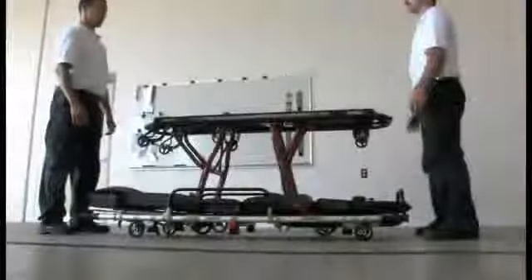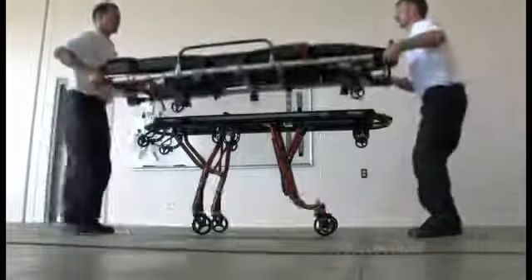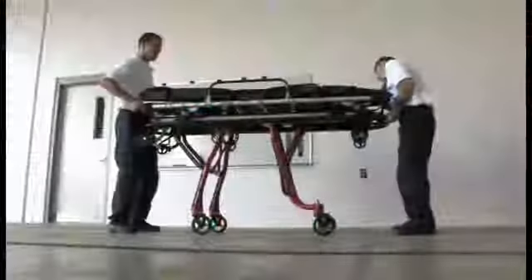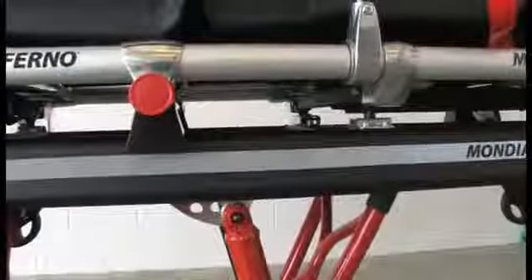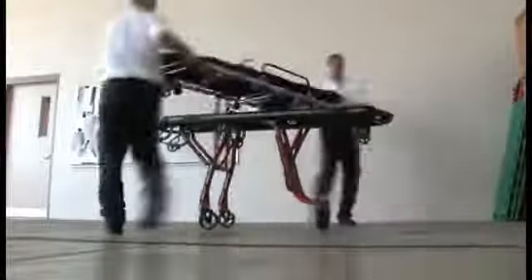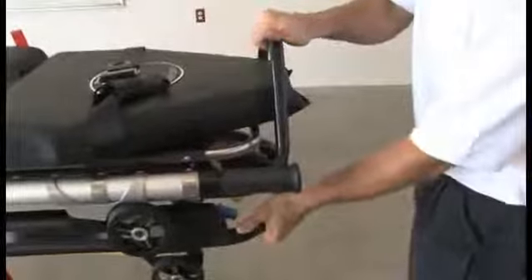To attach the stretcher to the transporter, lift the stretcher and position it onto the transporter slightly toward the rear legs, with the stretcher glides resting on the stretcher rail. Push the stretcher toward the front legs until it engages the slam latch mechanism and you hear an audible click. The stretcher can be placed on the transporter facing either direction. Confirm that the stretcher is locked in place before moving.